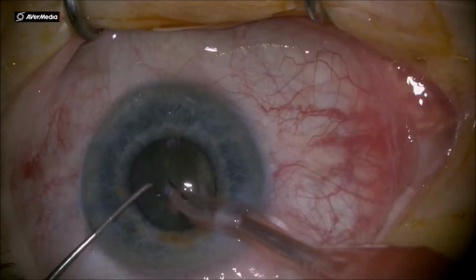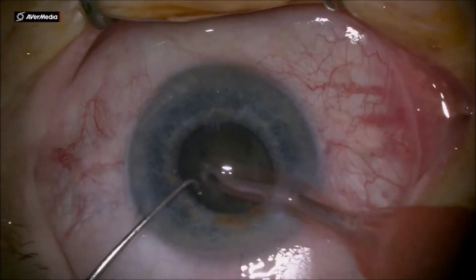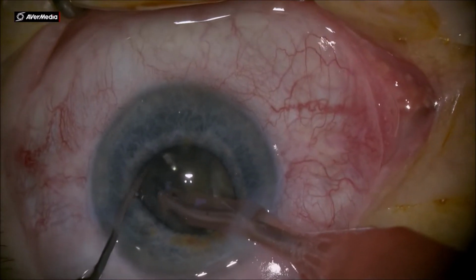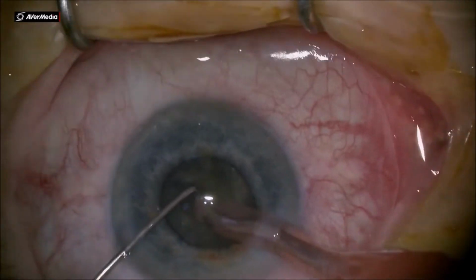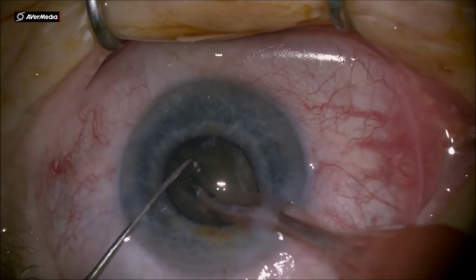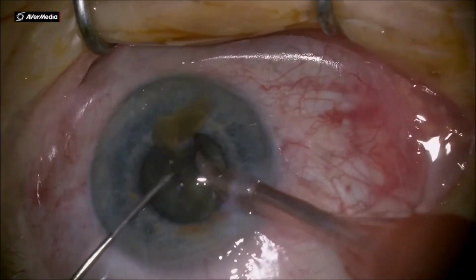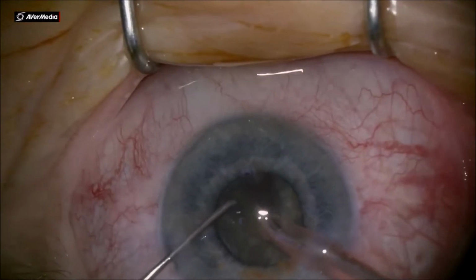You see the posterior capsule when you have an entirely cracked nucleus. When you have the posterior plate of the nucleus split, you'll see the posterior capsule and the red reflex through that crack of the nucleus. And I do a T-shape trench here, and having one heminucleus split into two parts. It's getting the phacoemulsification at lower risk level.